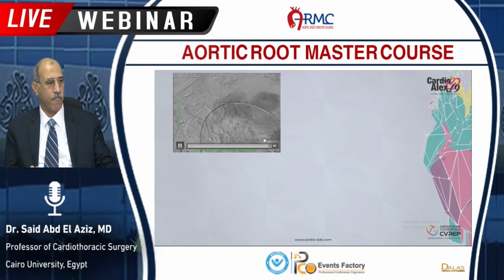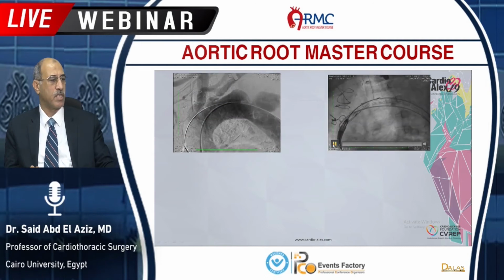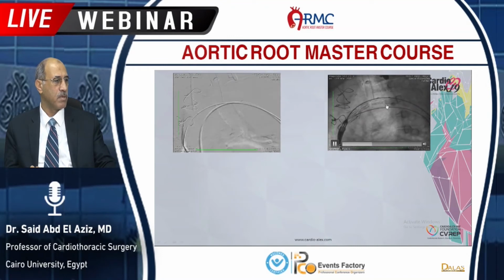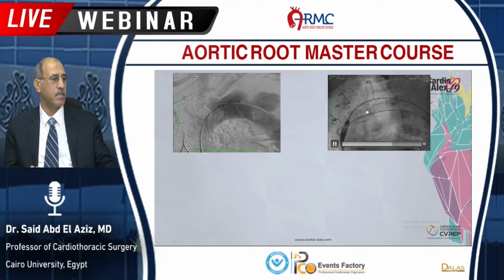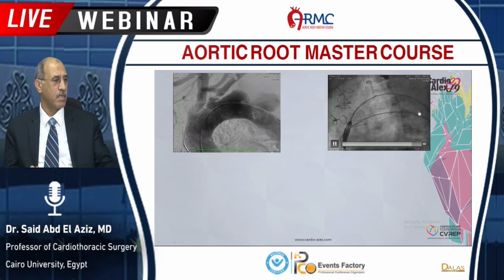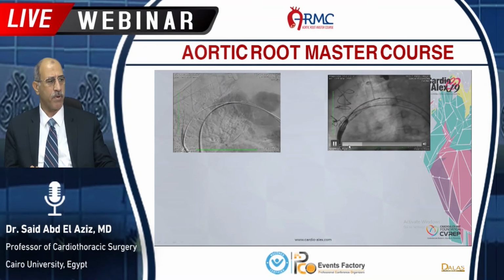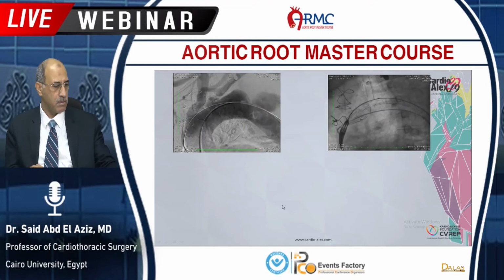The next one, we just introduced the stent, and here this is the pigtail, and we are deploying the stent cell by cell slowly, and during this period the blood pressure should be low to prevent pushing the stent away down.